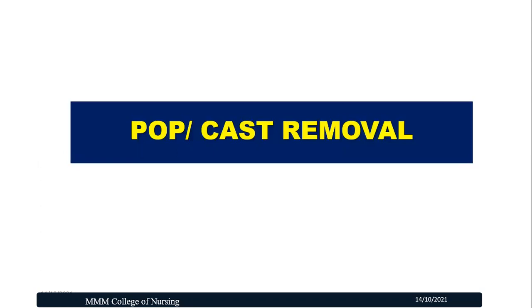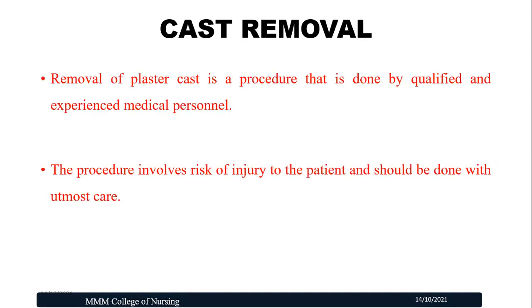This is about the application, drying, and care of the patient or care of the body part with the cast. Once the patient has worn the cast for a prescribed period of time, the cast has to be removed. So cast removal or POP removal is also an important responsibility that nurses need to understand. So let us discuss the cast removal.